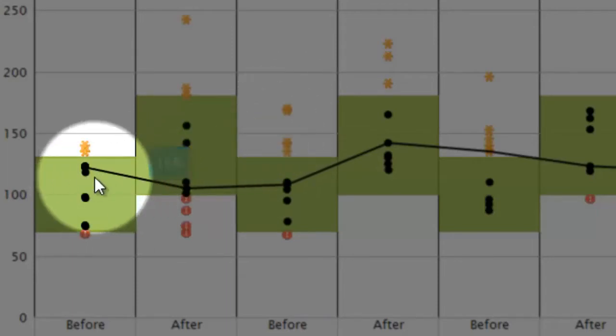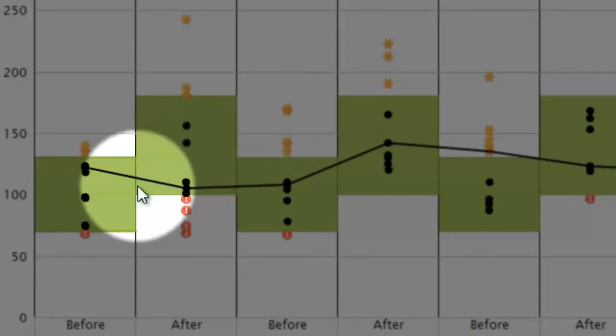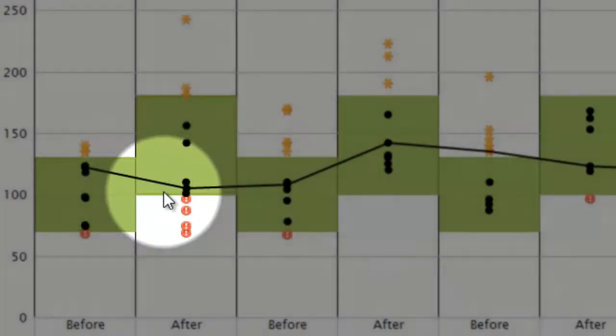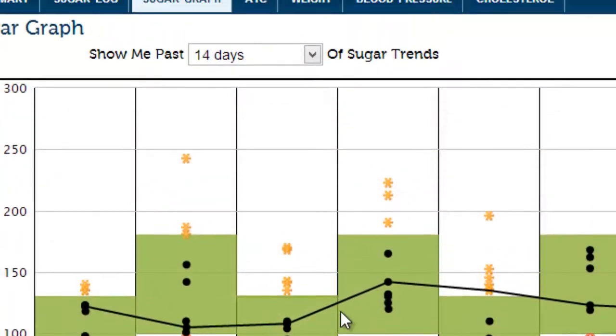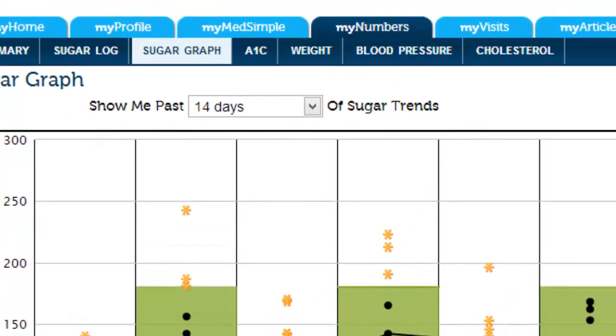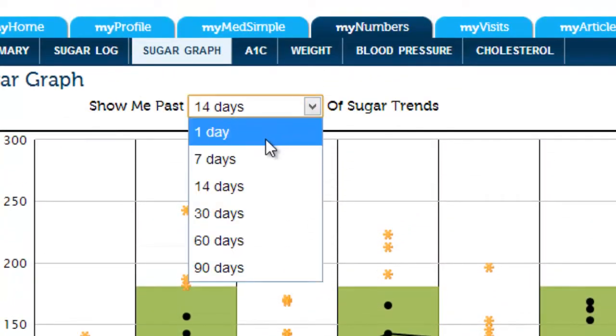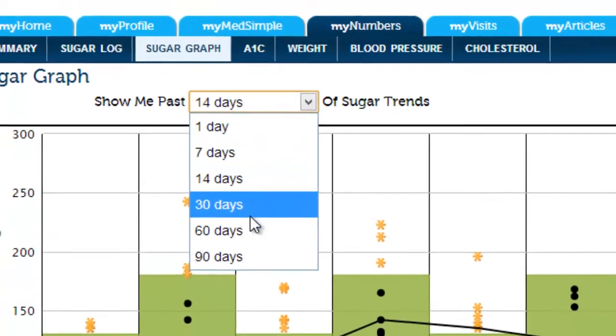The black line is the median, or the middle, of all the results you've entered. Up at the top of the graph, you can change the number of days from one day of results up to 90 days.